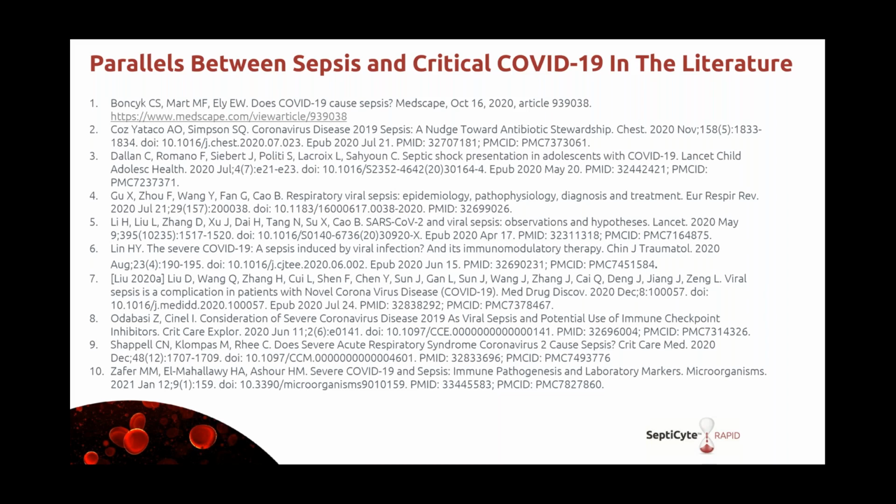Okay, thank you. And the second question, is it advised to use rather the Sepsis scores or the band interpretation? I think that the Sepsis scores have more relevance from the standpoint that they correlate with the probability of sepsis. The higher the score, the higher the probability of sepsis. For example, a score of 11 has an 82% probability of sepsis. As that score goes up higher in the 12 to 14 range, you're getting into 100% probability of sepsis. So I think the scores are more important.